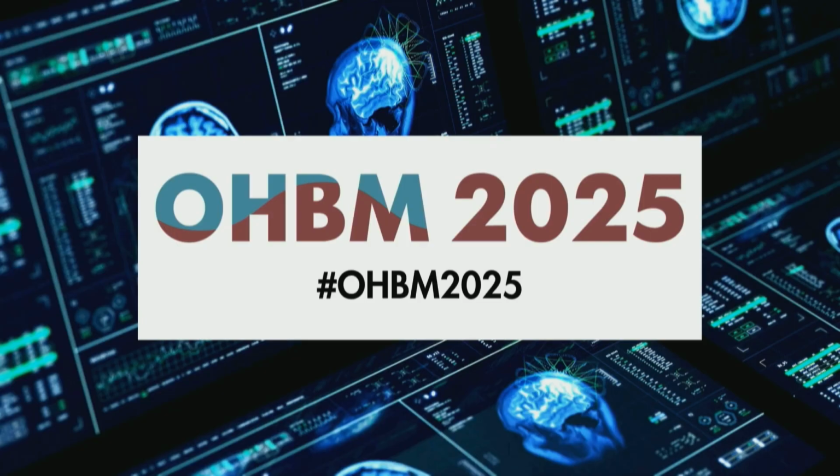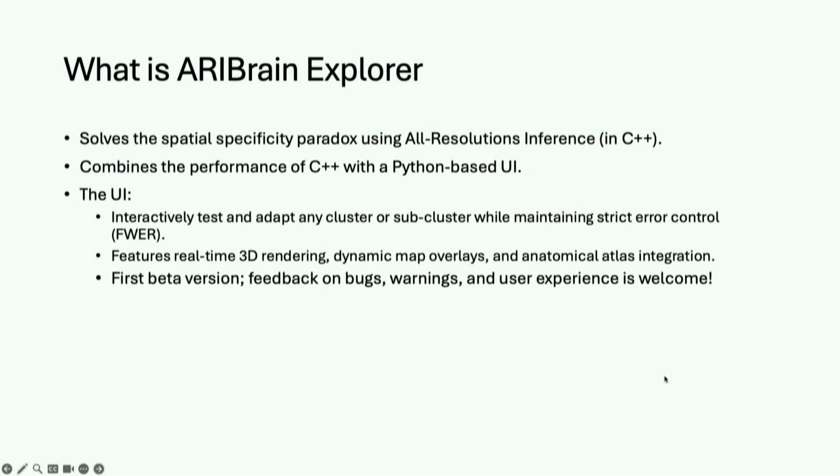fine. Yes. Okay. All right, so just a few words before I show the toolbox. So what it does, it solves the spatial specificity paradox, as just explained by Wouter, using the all resolutions inferences. The computations are done in C++, and we combine that with a Python-based interface. So with the software, with the interface, you can interactively test and adapt any clusters that you find in your data or subclusters while maintaining that strict control, this family-wise error rate.